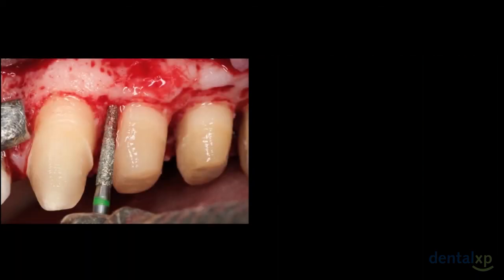Again, we're going back to starting on the tooth surface first using a C847-016 coarse diamond burr. Same as the other case, I want to create an environment with a perfect interface between the bone and tooth surface. Remember, there should be no margins remaining when this procedure is finished. I'll repeat that. No margin should remain when this procedure is finished.